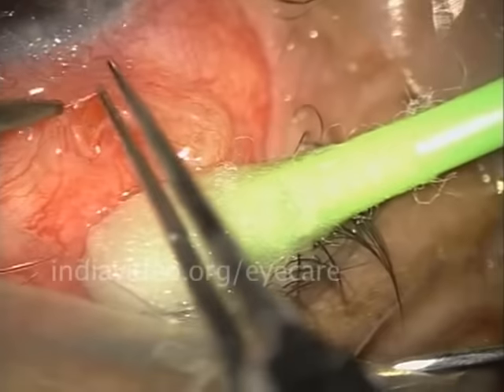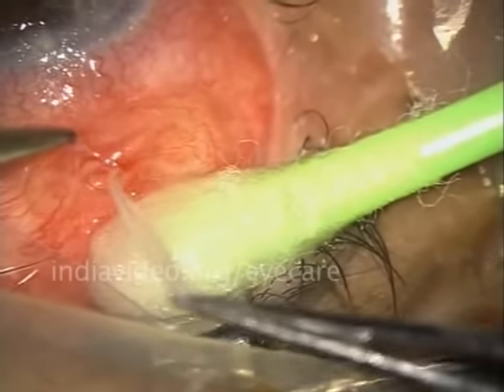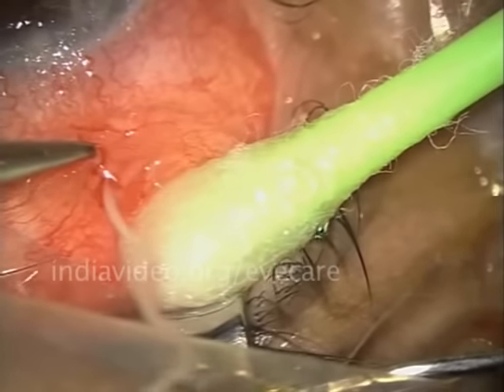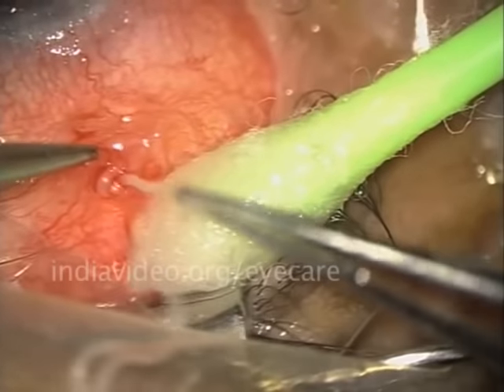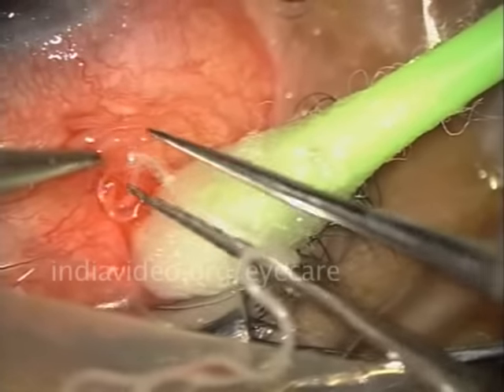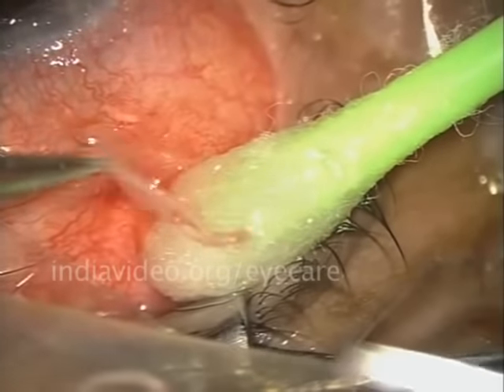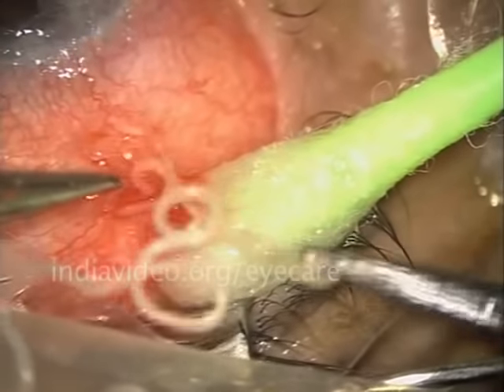I made an opening into the conjunctiva, which is not the seeing part of the eye — this is only the white portion of the eye. Now we can see some white cylindrical tubes likely to be a worm. I am pulling that out and you will be astounded to see the length of this worm. It is a live worm — you can see the head moving.